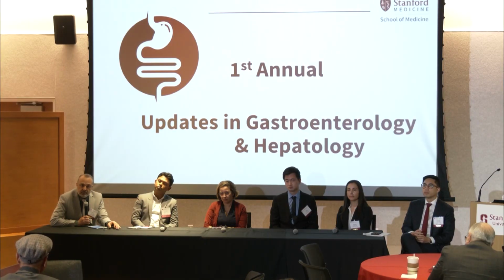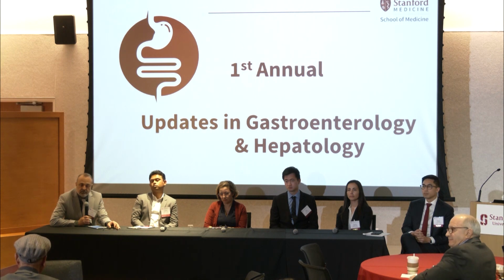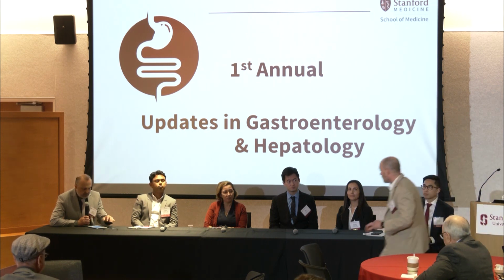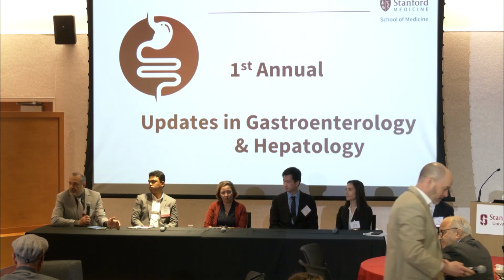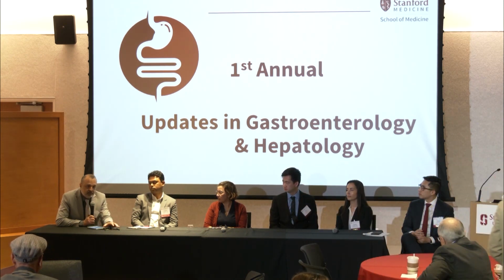Yes, there is a fairly high incidence of post-procedure pancreatitis with biliary manometry. We did some while I was in Southern California, but we had to be very careful. The comment was that there is a high risk of post-ERCP pancreatitis or post-manometry pancreatitis, and you used to leave a pancreatic duct stent to decrease that chance.